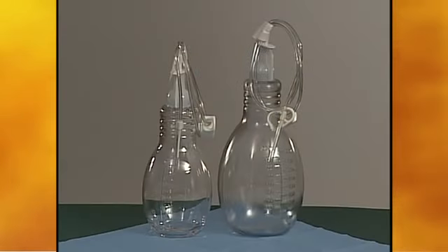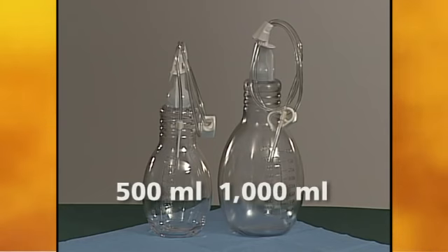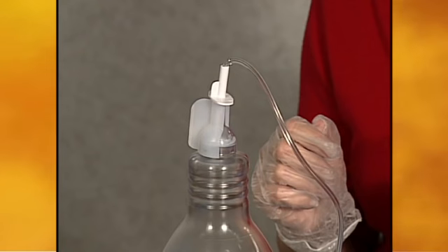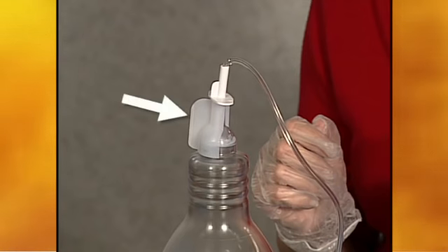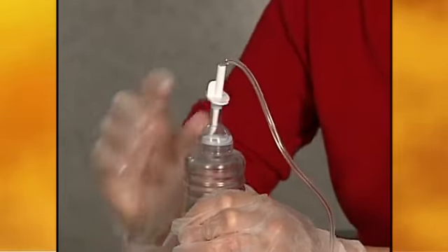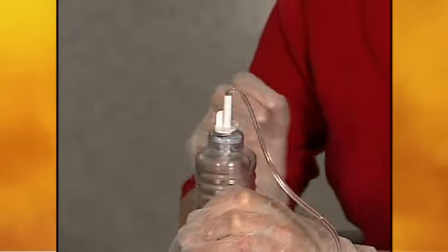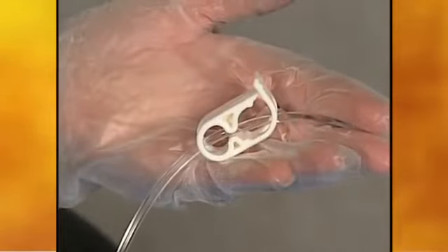There are two sizes of drainage bottles: 500 milliliters and 1,000 milliliters. Preparation and use of each bottle is the same. There is a vacuum inside the drainage bottle that provides suction to drain the fluid. The support clip on the drainage bottle ensures that the foil vacuum seal on the bottle is not broken until the patient is ready to drain. Steady the bottle with one hand and remove the support clip.